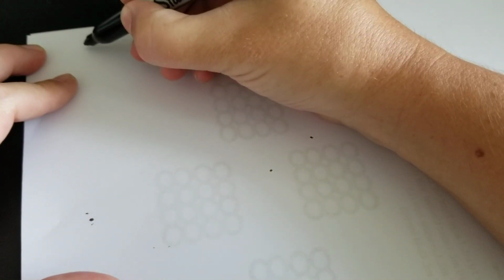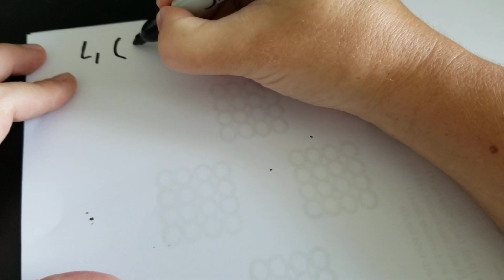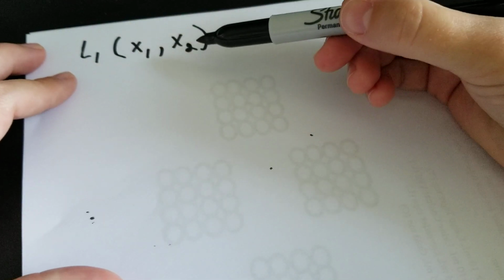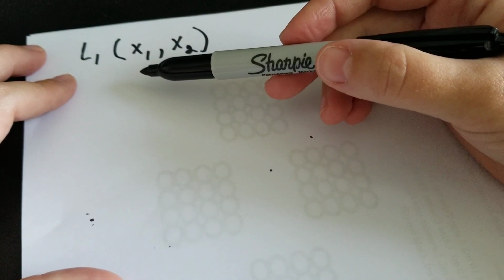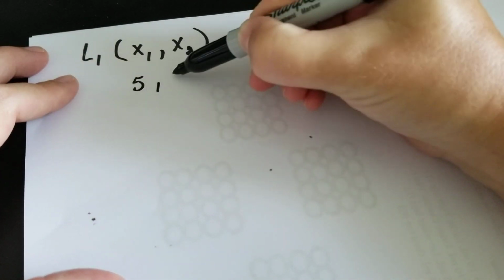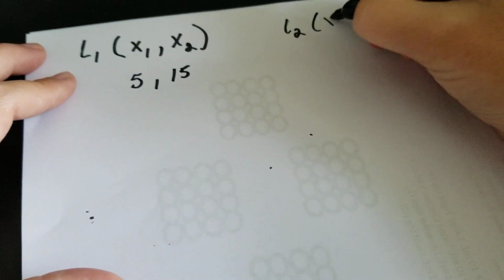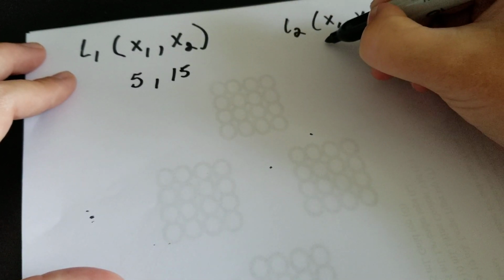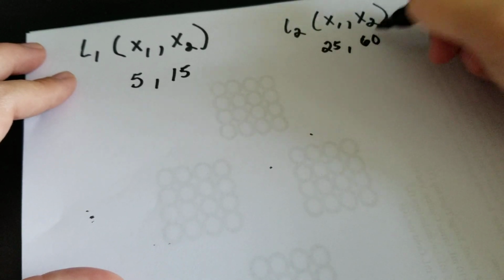All right, so for every level, the range basically is provided to you in this type of format. Okay, and so you'll be given a number here. So maybe this number is 5 and this one is 15. And for level 2, the same thing. And maybe for this one, it's 25, and this one, it is 60.